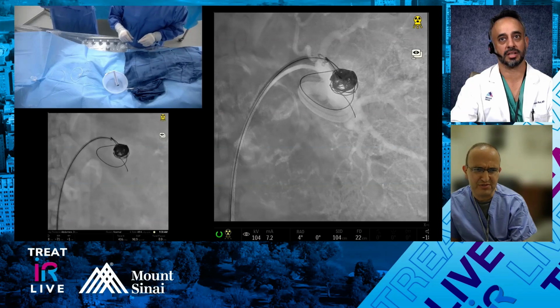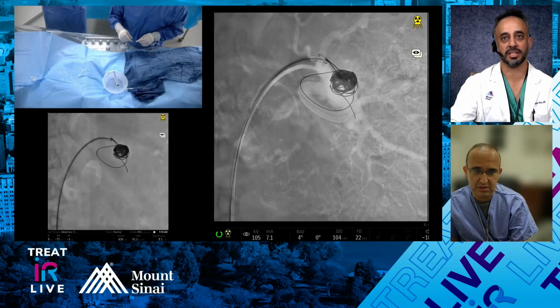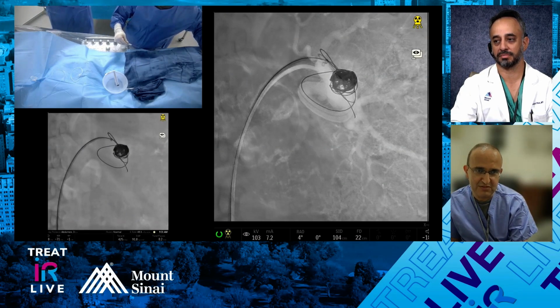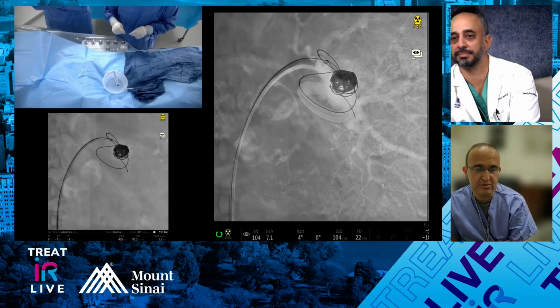Do you guys have longer pushables? So I only have the nesters, right? The micro nesters are 14. So this is basically three times the length of a micro nester. I know it's still more expensive than a pushable, but it definitely evens it out a little bit.